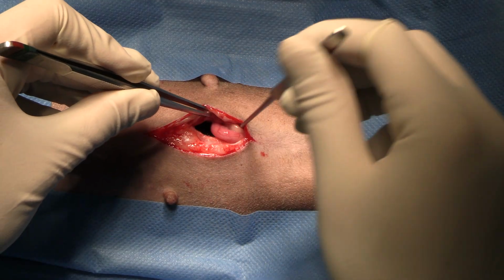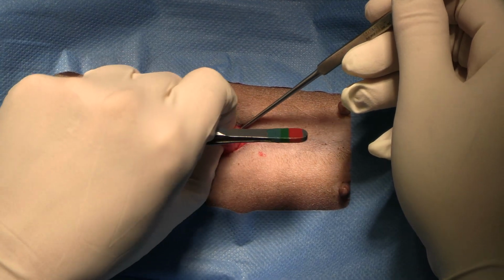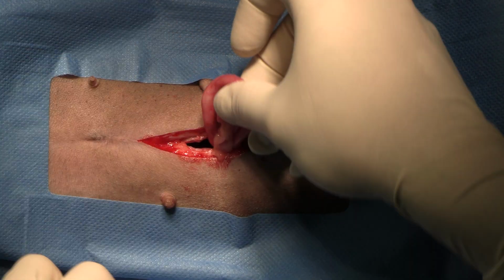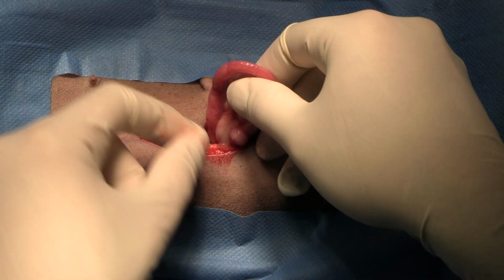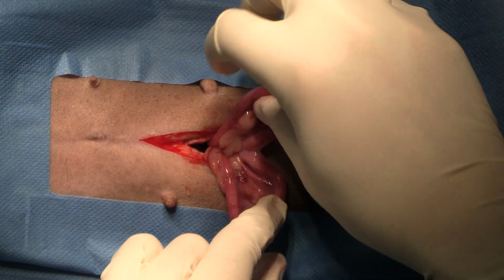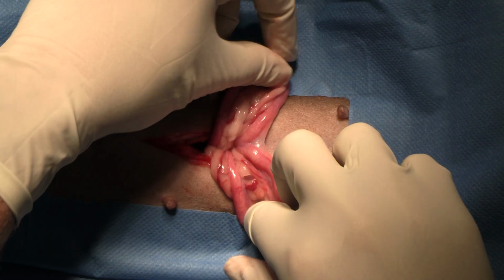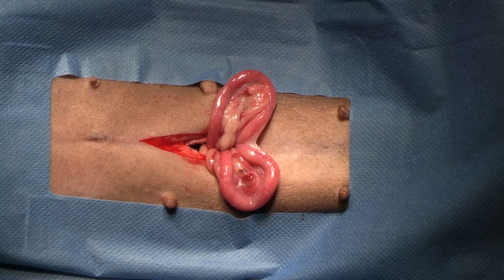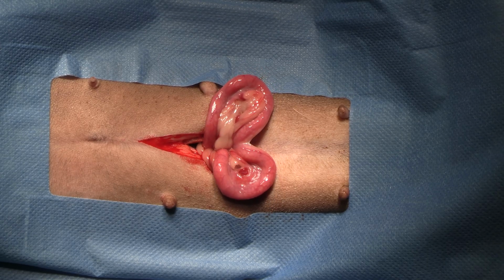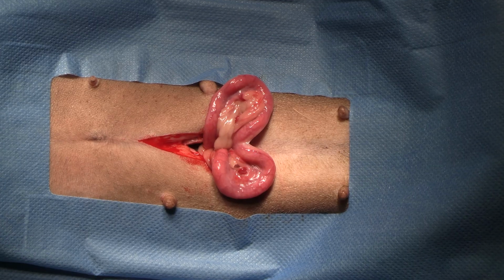Trying to find our uterus, there it is. We just want to expose both our uterine horns. There they are. And now I'm going to catheterize both our uterine horns. We do it with a 22 gauge blue catheter.